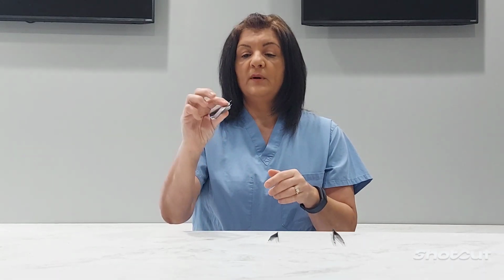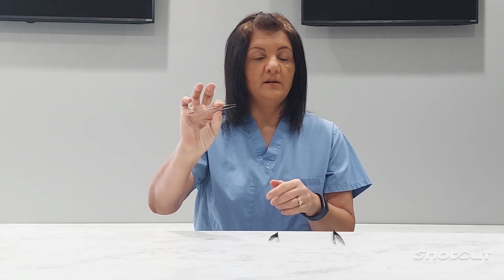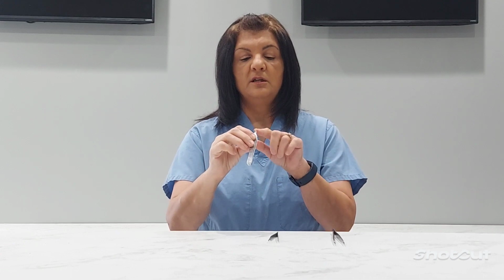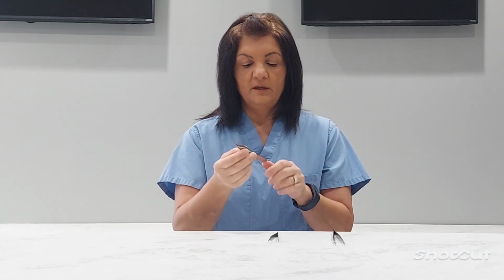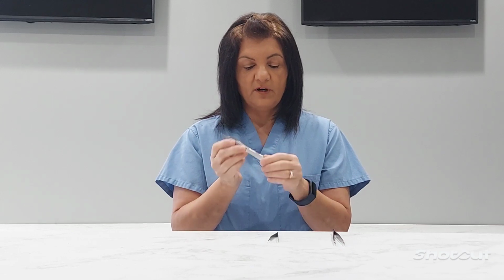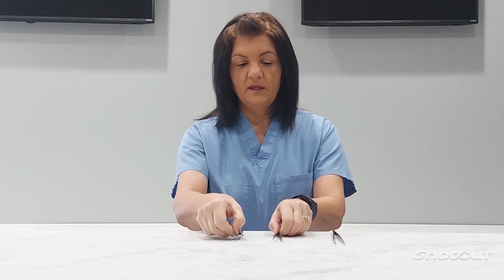To check for function, we want to make sure that the teeth come together smoothly. This particular one, I don't know if you can hear that, but it's making a clicking noise and it's sticking. That to me says that the teeth are not coming together correctly. And it's also got a little bit of a crack and a stain right there.